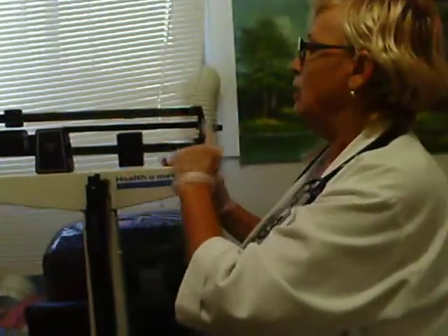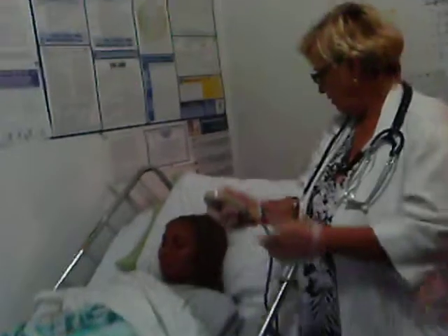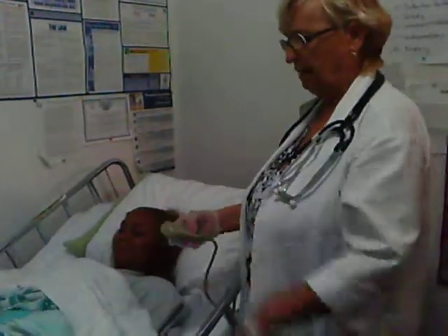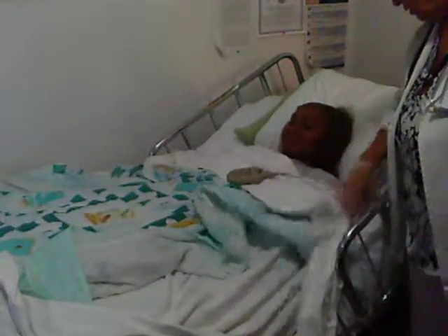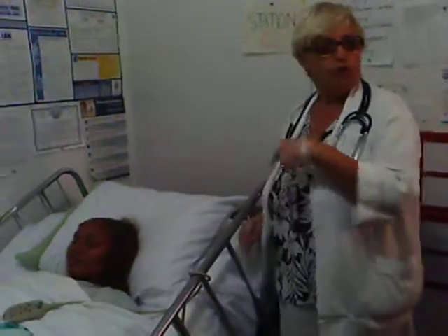They are not going to ask you to do kilograms — if they ask you, the scale should have a kilogram setting. Okay, Mrs. Green, let's go back to the bed. You walk the patient back. One, two, three — sit down. I am going to cover you. Are you comfortable? I put your head down a little bit — tell me when to stop. I put the feet up a little bit. I put the rail up, the wheels are locked, and I put the curtain down to remove the privacy.